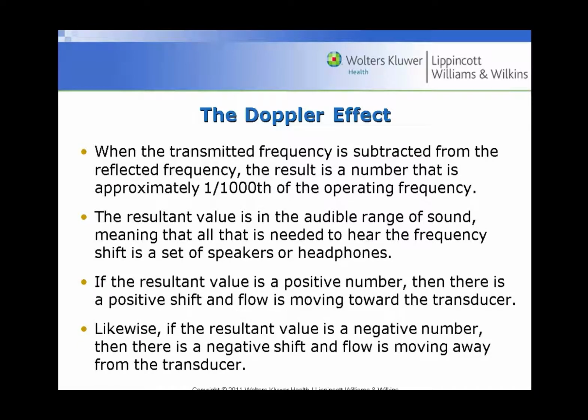A couple of things when looking at the Doppler equation on page 129 is that we see the Doppler shift will be in Hertz, meaning that we can hear the Doppler shift. And that's because when you subtract the transmitted frequency from the reflected frequency, this number is going to be about 1/1000th of the operating frequency. So we're going to drop from megahertz, or beyond human hearing, down into kilohertz, which will be now into where humans can hear it.